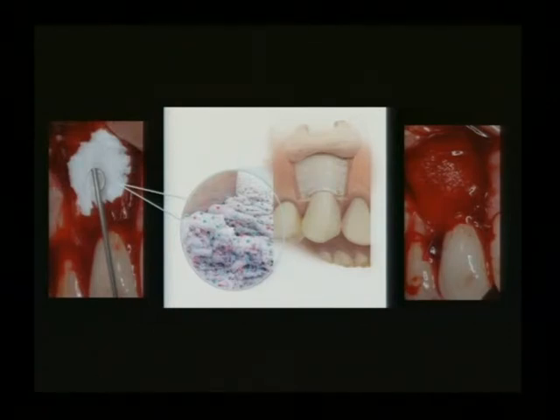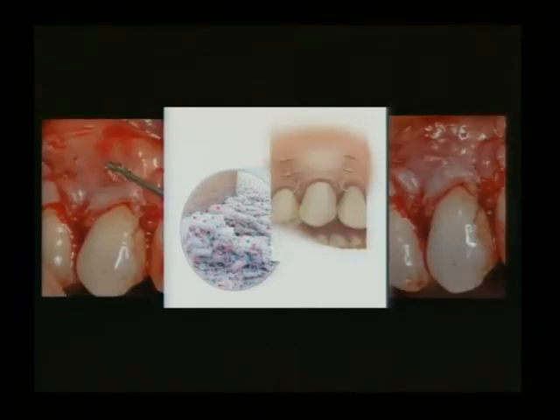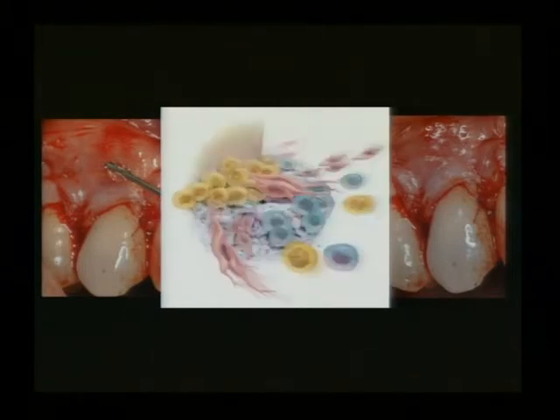And now we have it hydrated with blood and the PDGF. And I'm placing a little more PDGF after I've sutured because it stimulates wound healing. That's one of the things that PDGF does. Now, this is biosurgery. There's a lot going on there at that root surface.